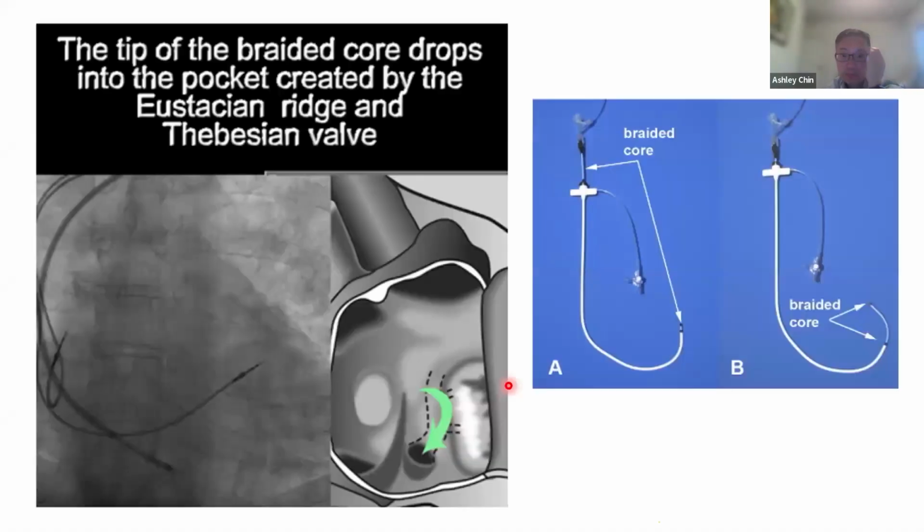All right, then, just some words about the Worley CSG system and the braided core system. What this system uses is a dye injection approach. There are no signals, so it's purely dye. It's got what we call an inner braided core, which is this blue catheter that fits through a 9 French outer CSG sheath. This sheath is quite nice because it extends right outside the skin. You follow the same principles as what I've done, but the design of the CSG sheath is quite designed to fall into the coronary sinus.